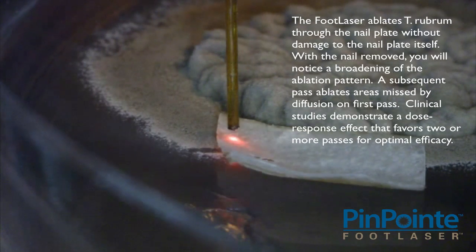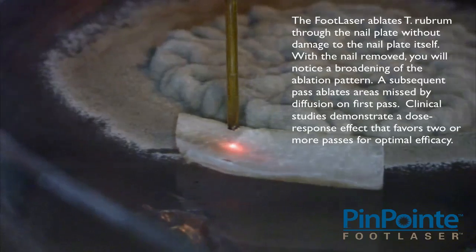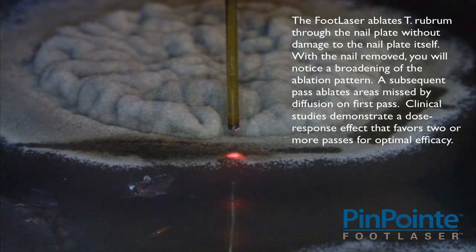The Pinpoint Foot Laser ablates T. rubrum through the nail plate without damage to the nail plate itself. With the nail removed, you will notice a broadening of the ablation pattern. A subsequent pass ablates areas missed by diffusion on first pass. Clinical studies demonstrate a dose-response effect that favors two or more passes for optimal efficacy.